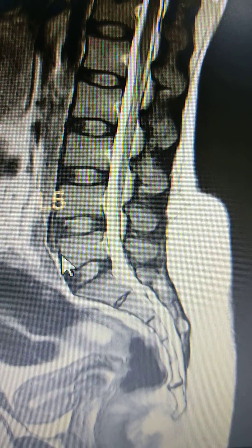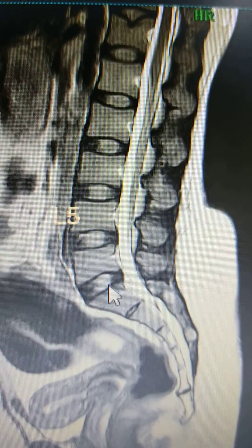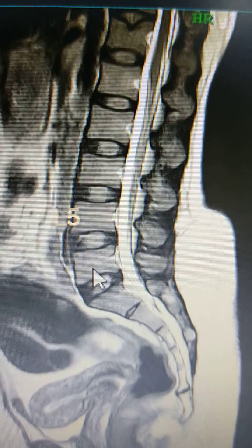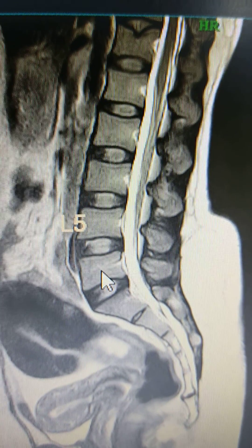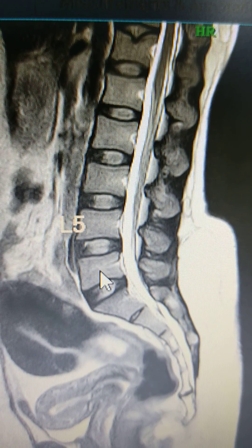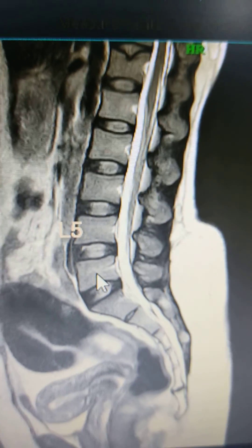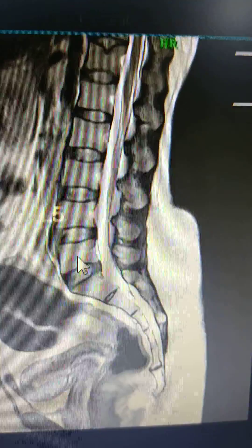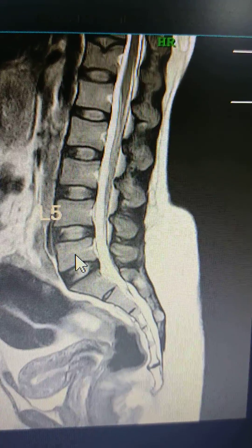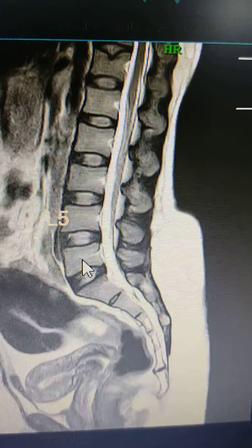So this is the S1 vertebra. As you can see, there is a lumbarization of the sacral vertebra. There is a classification for this.